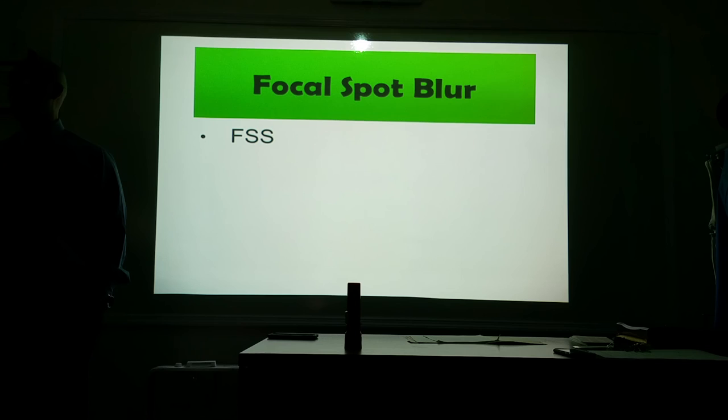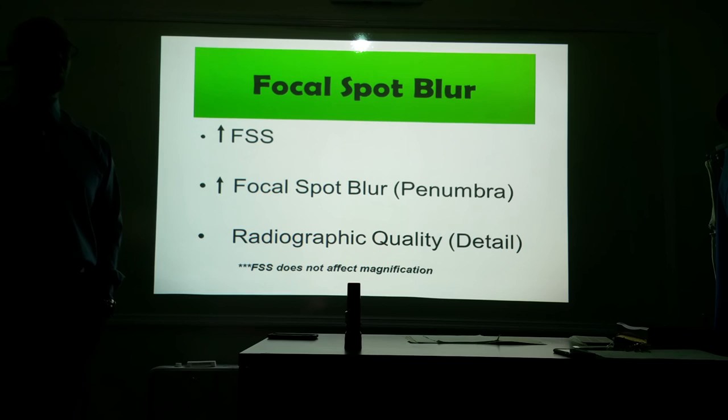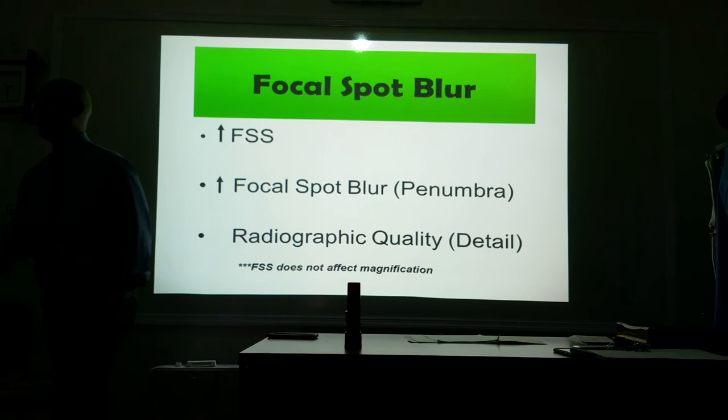All right. I'm not going to spend any more time on that. Okay. I've killed it. Focal spot size. That's focal spot blur. The larger the focal spot size, the more blur that you get. Focal spot size does not affect magnification. What affects magnification? SOD. Distances. Yeah, any changes in your distances are going to affect magnification. So focal spot has nothing to do with it.